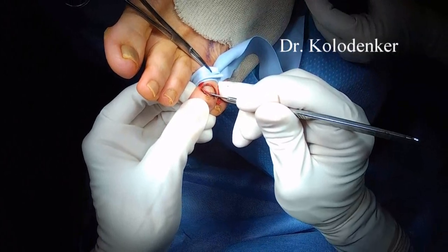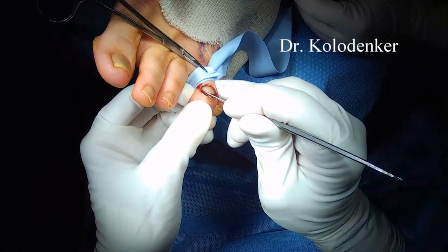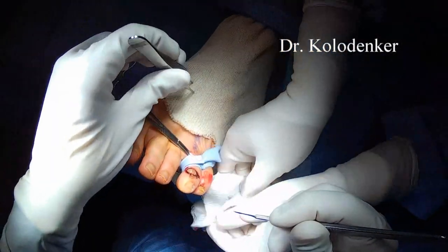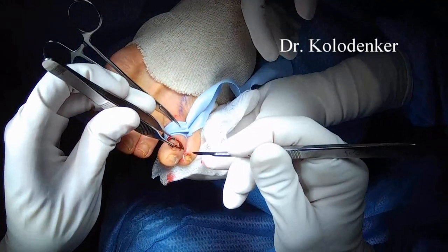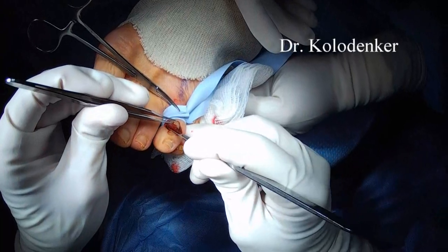Large flaps are ideal, so when you're making the incision, try not to skive — elevate a thick piece of skin. Minimal contact with the remaining skin layers is really important.